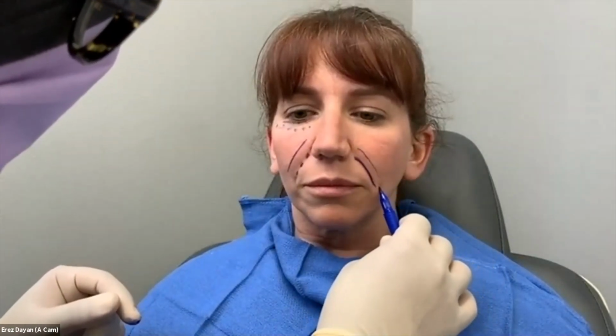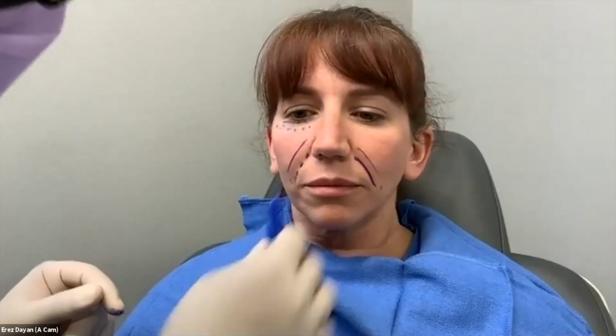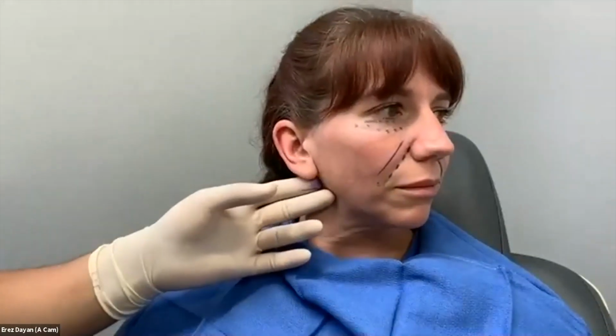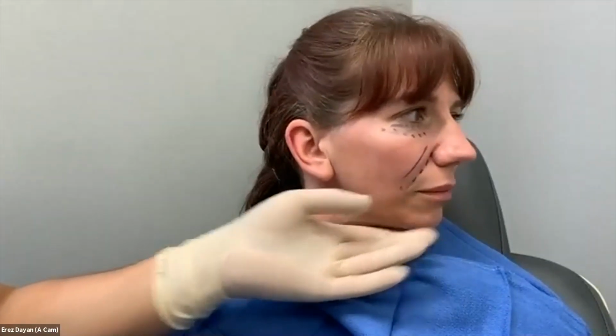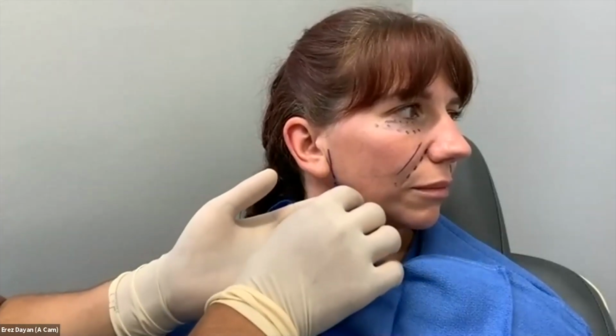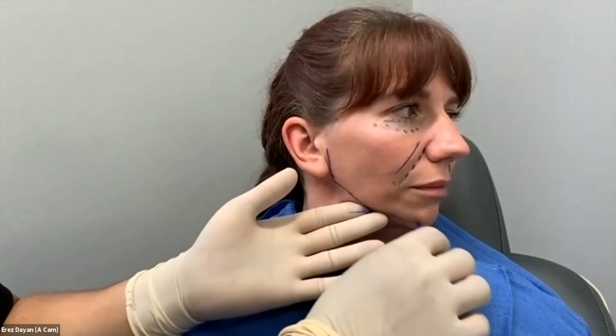And my access is going to be right here. I'm just going to do a little poke here. So Accutite's really easy for isolated areas, just like we're going to do. Now, I'm going to mark her out as if I were going to do a full FaceTite, and I'll show you exactly kind of what's involved here. So I'm going to have you look at the window there. Perfect. Good. A little more. Okay. So I'm going to mark the border of her mandible just as a reference.